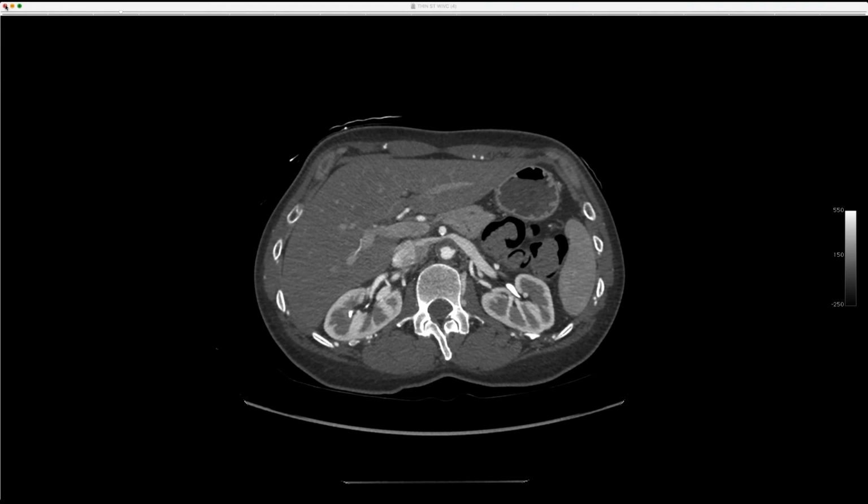Okay. And in this, Jeff, what is the etiology? Is it thrombosis, Leriche syndrome? I forget. Yeah, it's just bad atherosclerosis of the aorta. And I like the case because the collaterals were quite impressive. Let me see. I'll show one more for time.